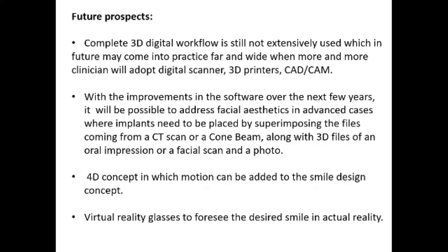A lot of clinicians will transform as digital clinicians. With the improvement of the softwares in the next few years, it will become much easier and much less cumbersome to do this procedure. And the 4D concept is in the cards, and it has already started in the Western world, and slowly people are adapting to it. Compared to the three-dimensional workflow, the four-dimensional workflow can motivate the patient even better. And even virtual reality glasses are available to foresee the desired smile in actual reality. So these are all the future perspectives.